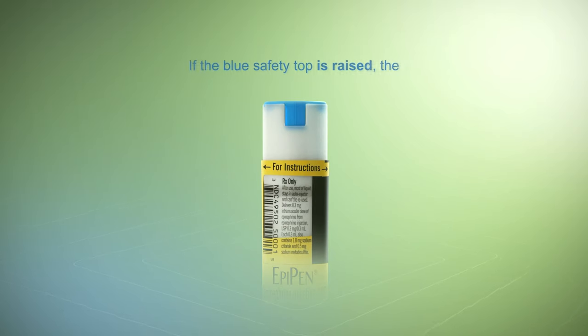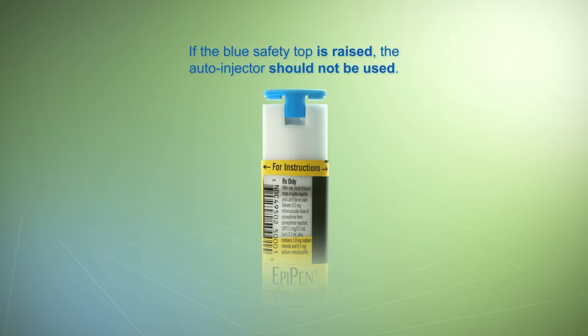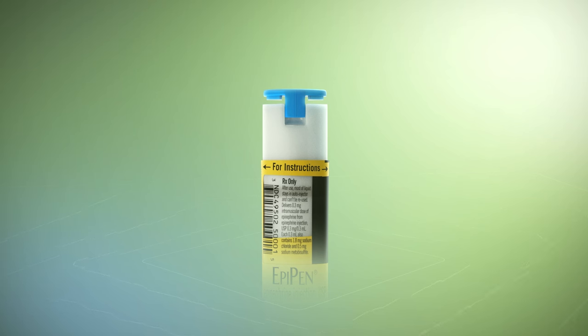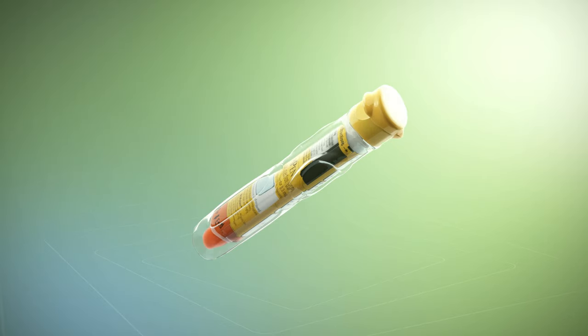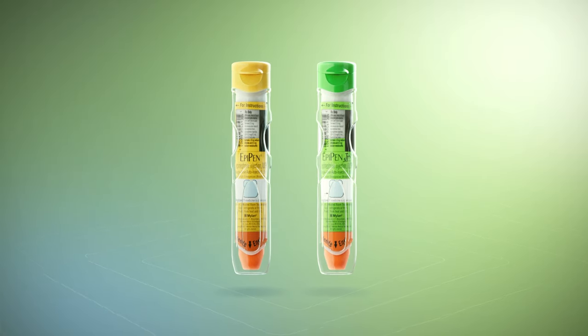If the blue safety top is raised, the auto-injector should not be used because the device could activate by accident. Do not try to push the blue safety top back down. Put the auto-injector back in the protective case and replace it with a new EpiPen or EpiPen Jr.